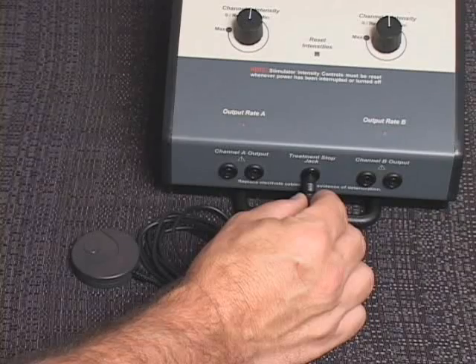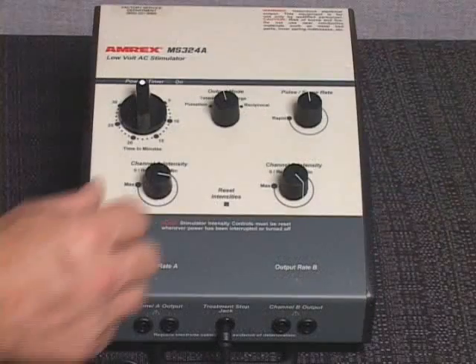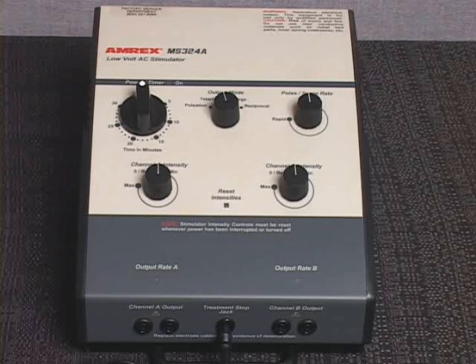Connect the patient treatment stop switch to the treatment stop jack. Rotate the intensity control knob or knobs to the zero reset position, enabling the audible click or clicks.